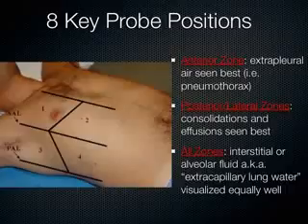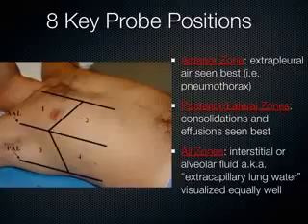This patient is lying down. Most of the patients you'll see in the hospital are lying down that we ultrasound, although it is possible to image the back. And what we're teaching you today is primarily we focus on the anterior because there's gravity, and essentially if you're on your back for any length of time, any kind of fluid in your lungs will go to the back and you'll get false positives. So we really want to image the front and the sides to tell us what is going on in the lung. Anteriorly is the best place to look for pneumothorax, and we'll talk about that in a few minutes. But if you think about it, if you're supine and you have air that has escaped from inside the lung into the pleural space, where is it going to be if you're on your back?